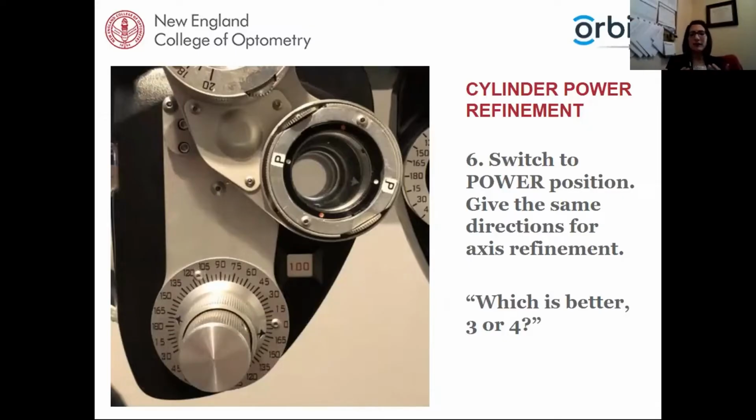Is it better 1 or 2? 3 or 4? 1 or 2? 3 or 4? And so when you're giving those options, they won't necessarily know that, okay, now we're doing the axis versus now we're doing the power, so the directions are the same. Tell me if one looks better than the other or if they look about the same.